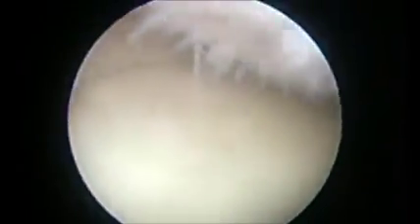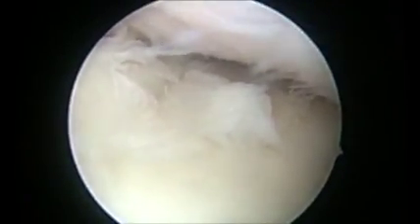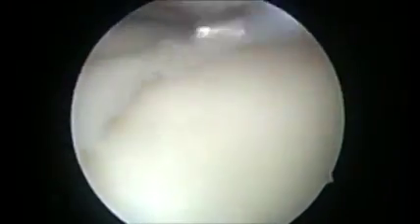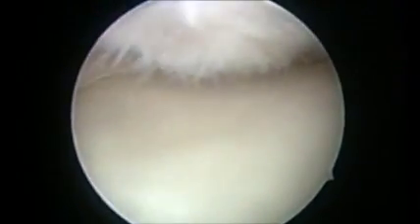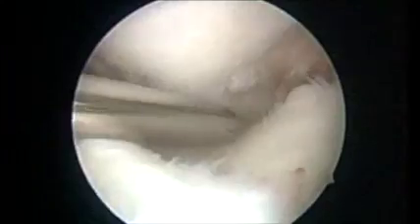Now coming back to the index case, we see a lot of degenerative changes on the femoral condyle, and at the same time there is complex meniscal tear in the posterior horn of medial meniscus. One of the theories behind the formation of popliteal cyst is the overproduction of synovial fluid due to intra-articular pathology, and arthroscopic assessment and treatment gives us the opportunity to take care of this intra-articular pathology.